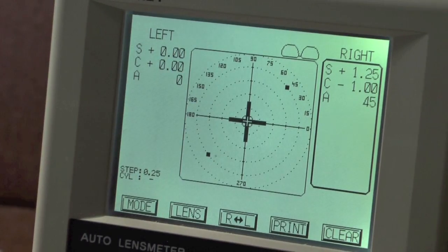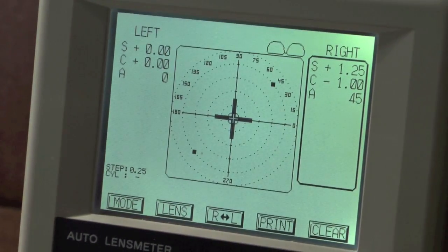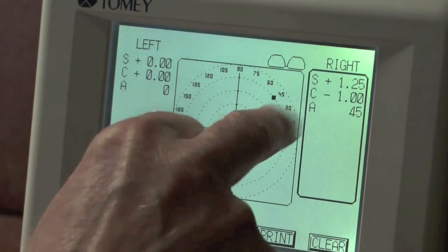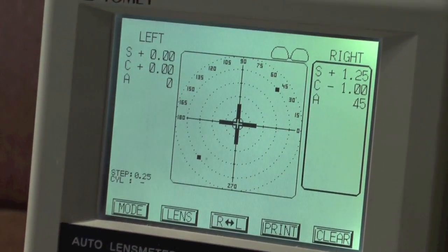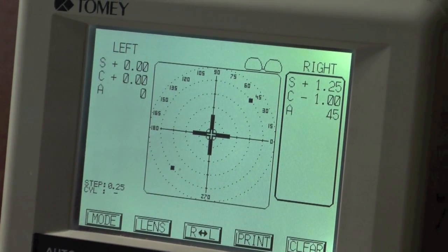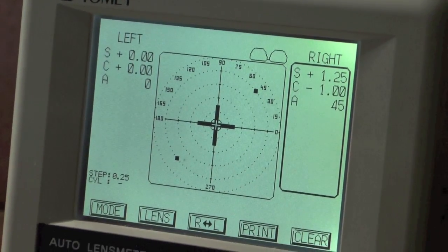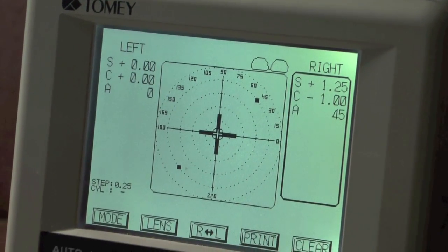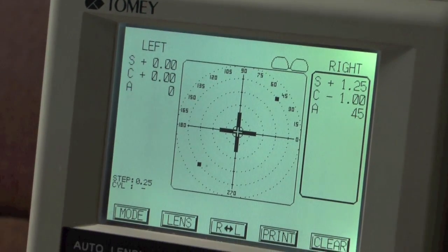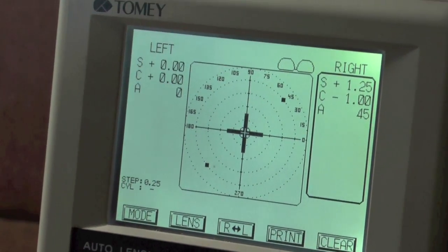And so when you get that nice sharp, you know it's in the right place. And let's look at the prescription there. Plus 1.25, minus 1, axis 45. Absolutely spot on. That's exactly what we wanted according to the prescription that we started with. So the right lens we know is absolutely correct.